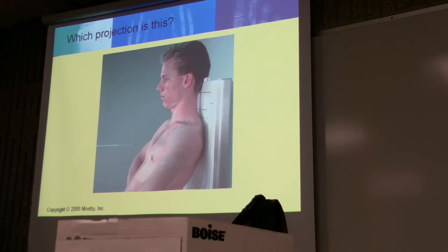Okay guys, don't take notes. Again, I'm just showing you, okay? So this is later on. I'm just introducing you to different terms. I want you guys getting used to hearing these terms, okay? Okay, AP axial projection, lordotic position.